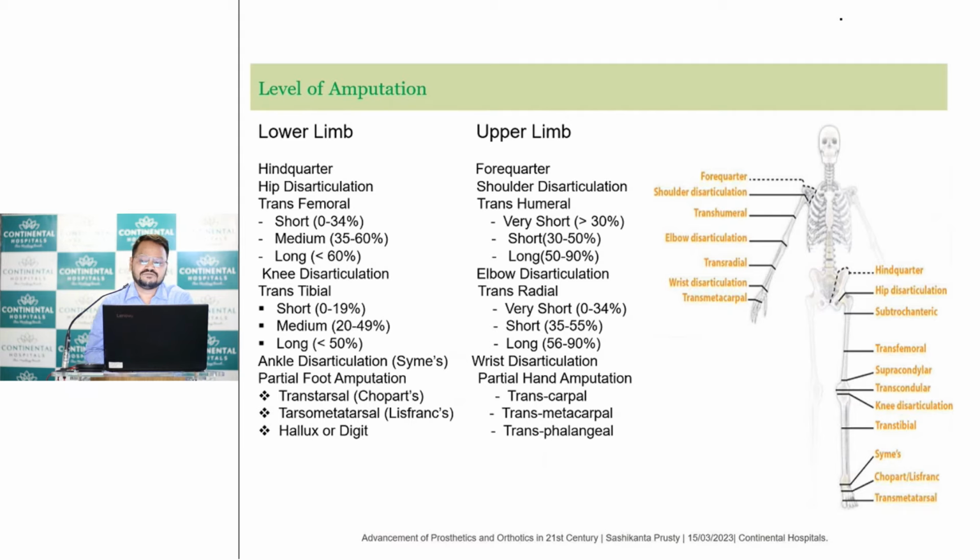Nowadays we see many cases with finger amputation. For any specific finger amputation, we are not able to give any kind of movement in those conditions because we don't have a leverage. So at some point we give cosmetic restoration.